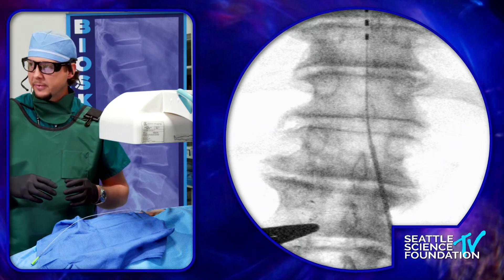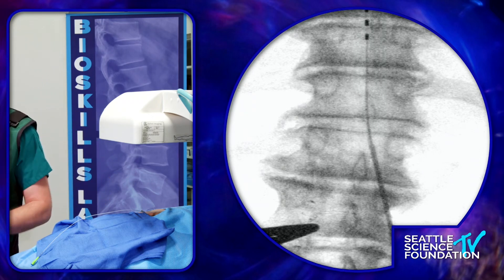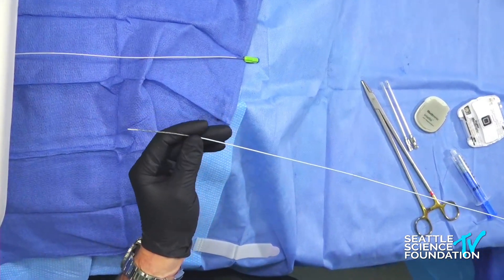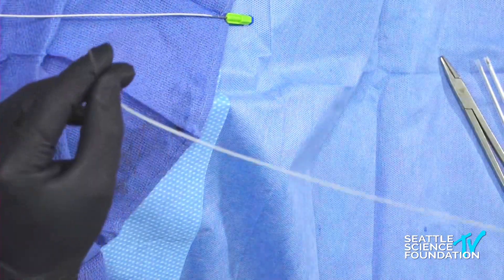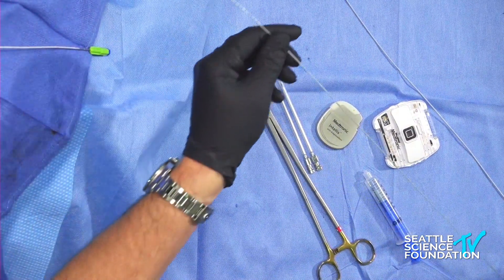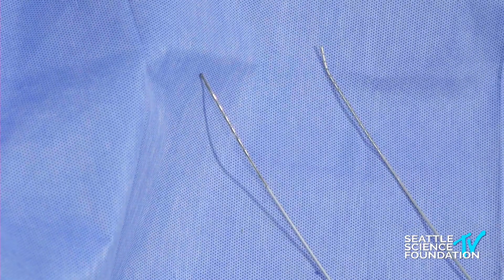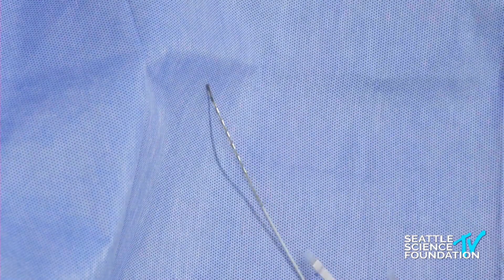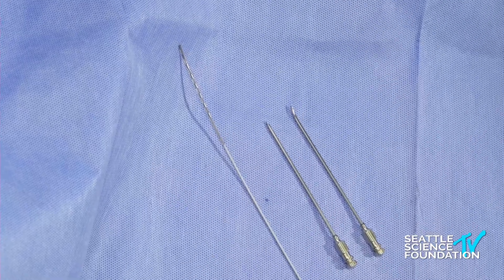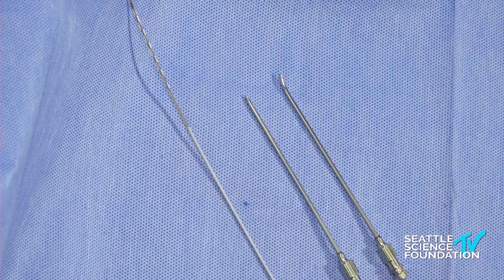You'll see it's at the entry of T11-12, which in the setting of what's already been done here, I thought was appropriate — it was a nice wide-open interlaminar space. Before placing a second lead, I wanted to highlight that there are different types of leads for trials and permanent placements. Today we've got Medtronic and Boston Scientific. The Medtronic lead already in has a curved-tip stylet with eight electrodes, and then Boston Scientific's Infineon with 16 electrodes. Similarly, there are different types of needles. I generally use a straight-tipped needle, though kits also include a curved tip and a Coup Dei option — it's all personal preference based on what you're most comfortable with.